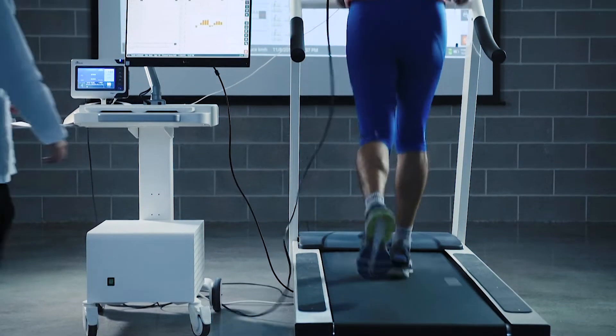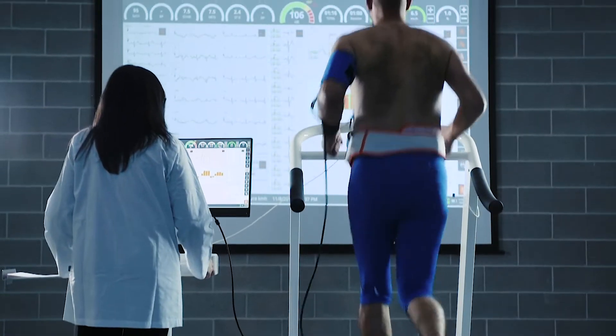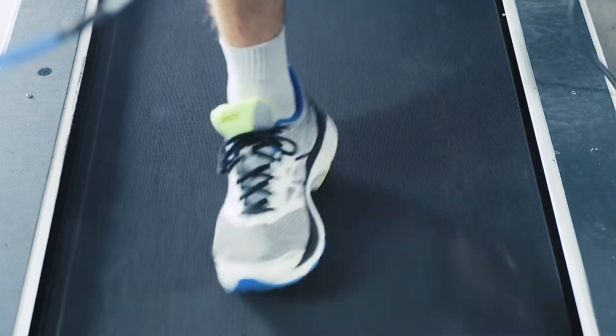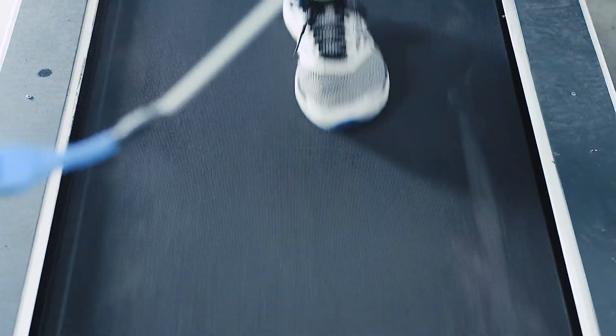In conjunction with the Cardioline ECG Web App, Cube Stress can store and retrieve the full test allowing web-based remote stress execution and physician review.